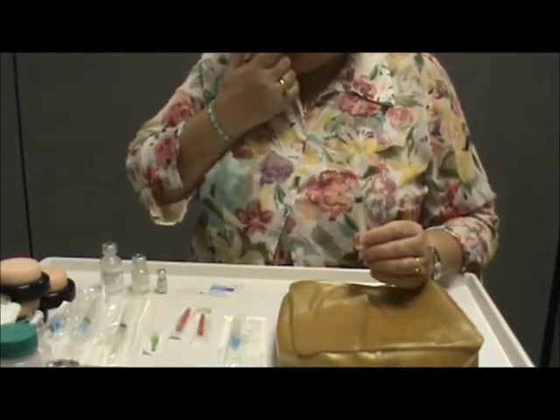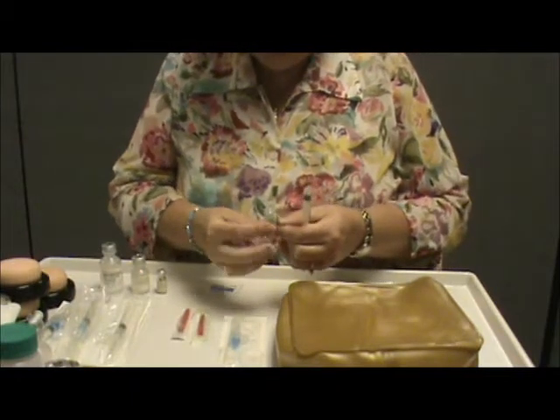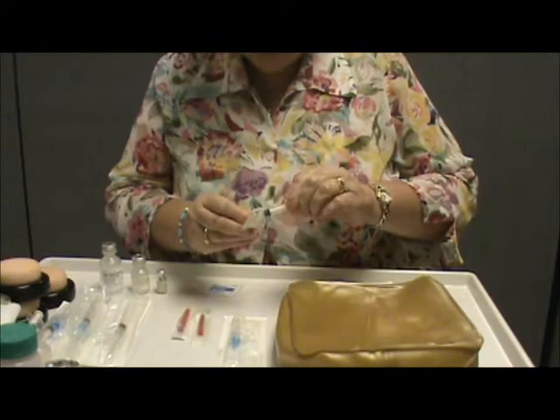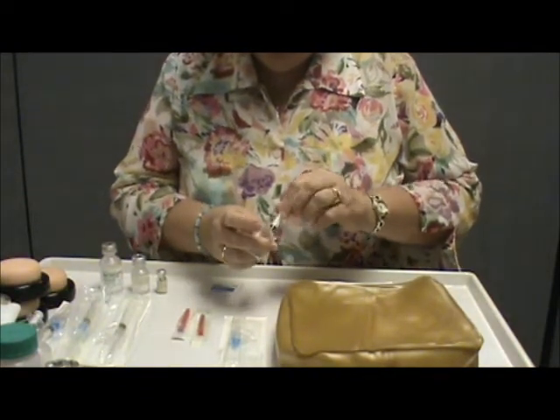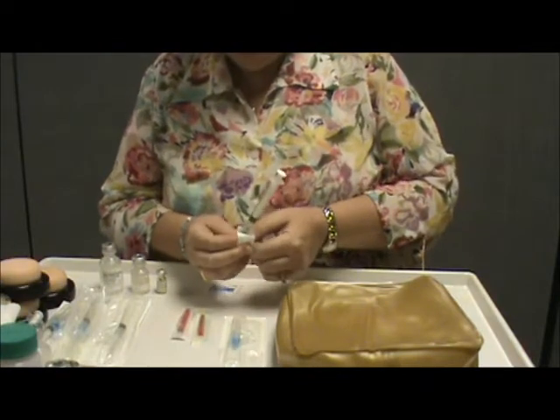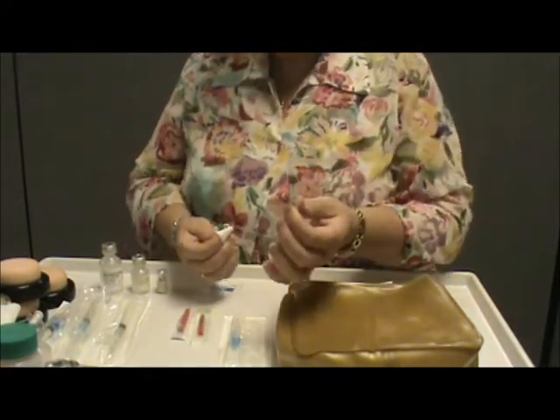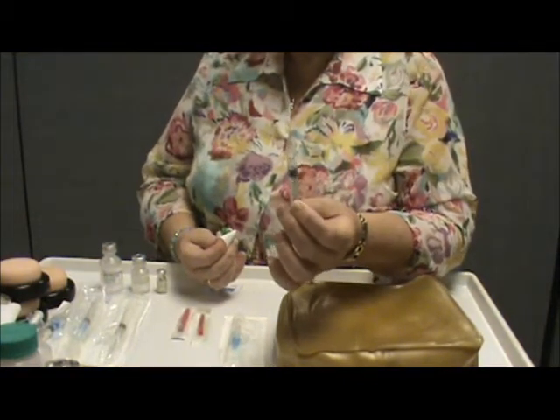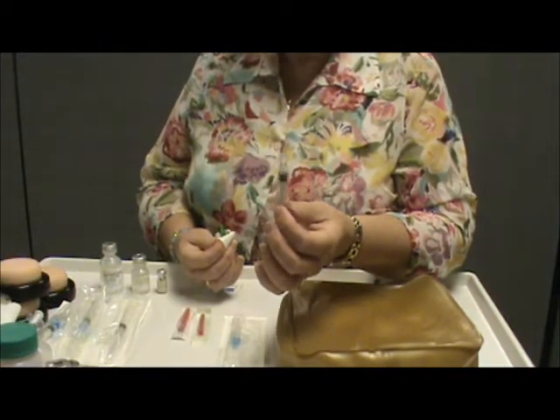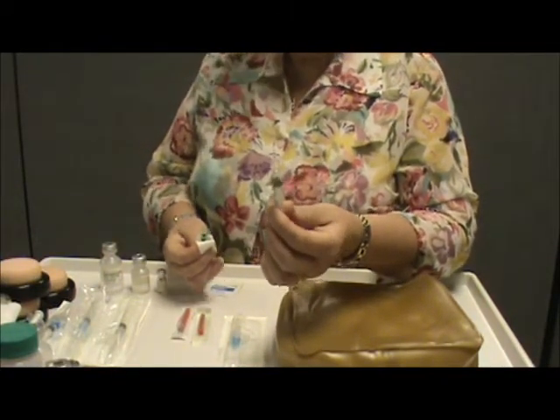There's different products on the market. This little guy is one. It is all plastic. When you're opening it up, make sure that you just hold your edges of your paper down out of the way. And then, anyway, here it is. It is just a sharp piece of plastic. Again, one method for avoiding using a sharp at the nurse's station.